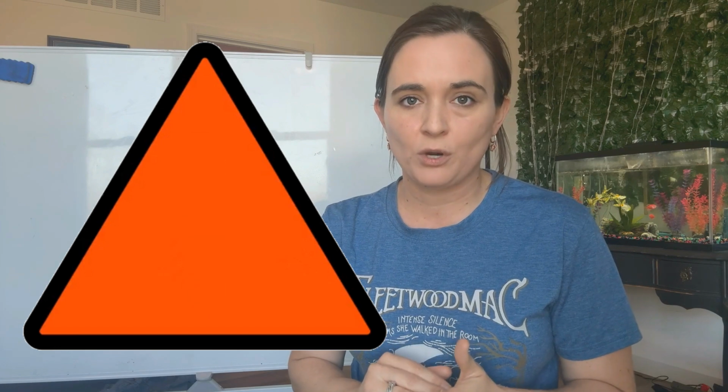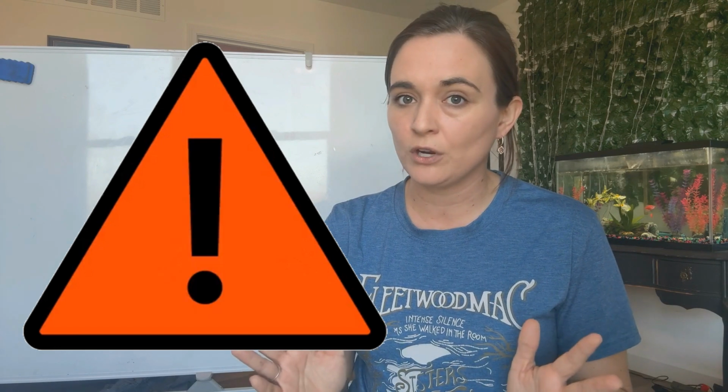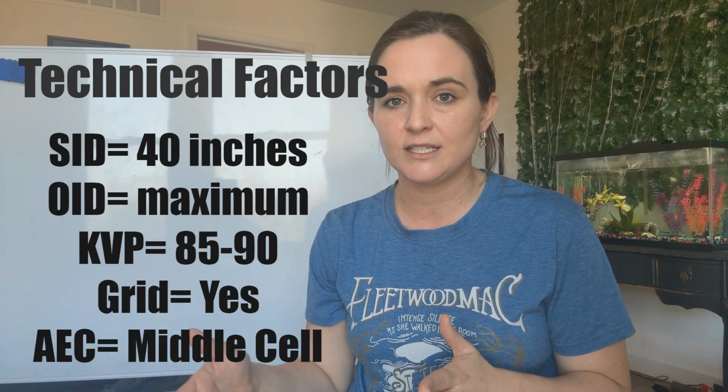Now let's say Mrs. Garcia is in spinal precautions. You can't move her. Enter the dorsal decubitus. Leave her supine, laying flat on her back. Stand the IR next to her side. Use a horizontal beam to shoot across her body. You're using the same 40-inch SID.